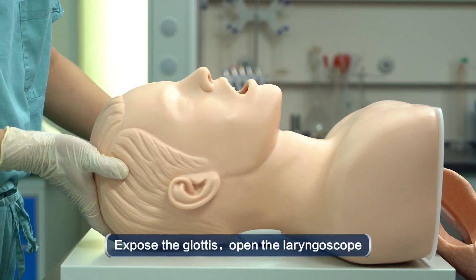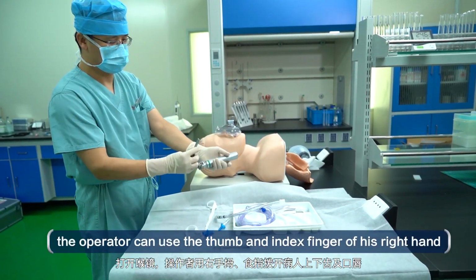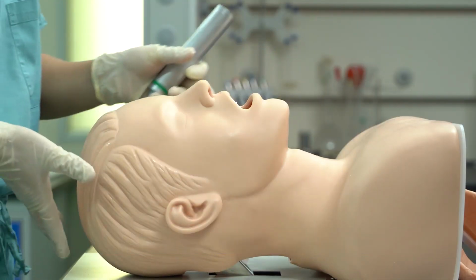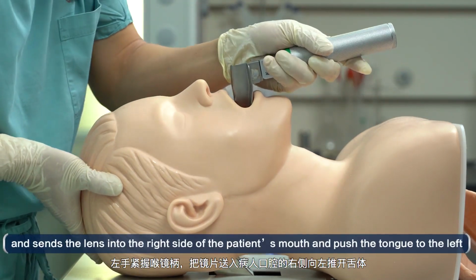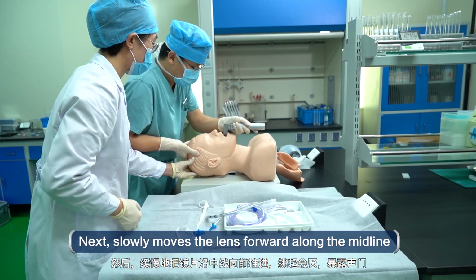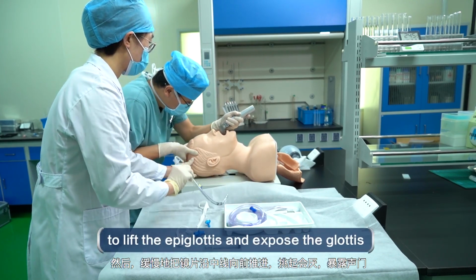Expose the glottis. Open the laryngoscope. The operator can use the thumb and index finger of his right hand to open the patient's upper and lower teeth, mouth and lips, and then use the left hand to grip the laryngoscope handle tightly, and send the lens into the right side of the patient's mouth and push the tongue to the left. Next, slowly move the lens forward along the midline to lift the epiglottis and expose the glottis.